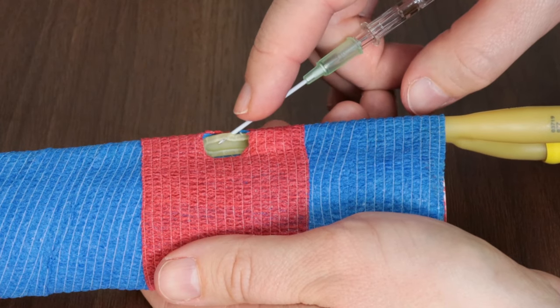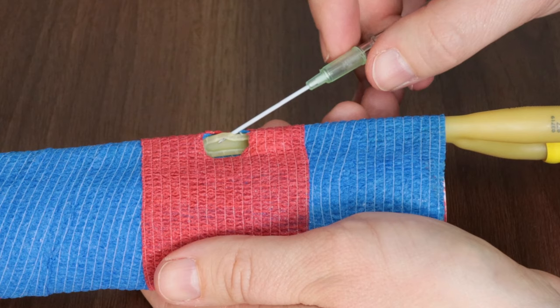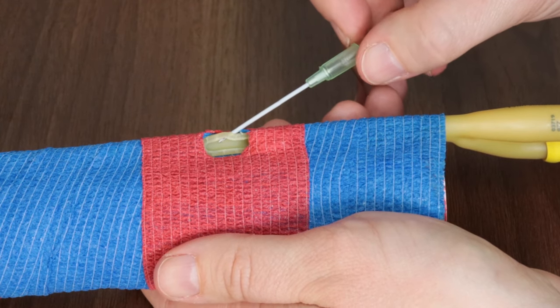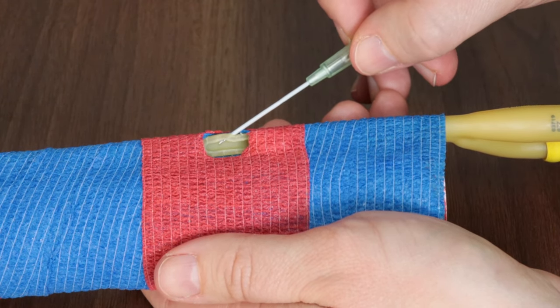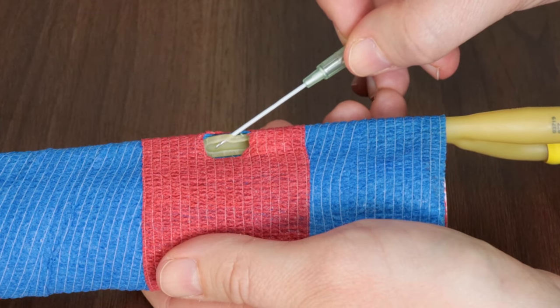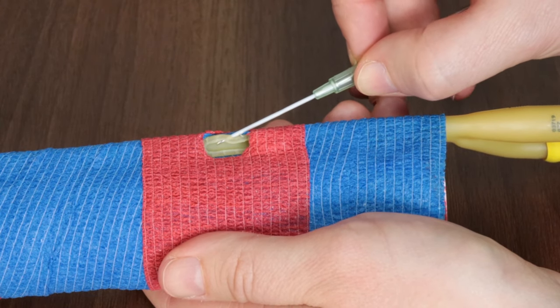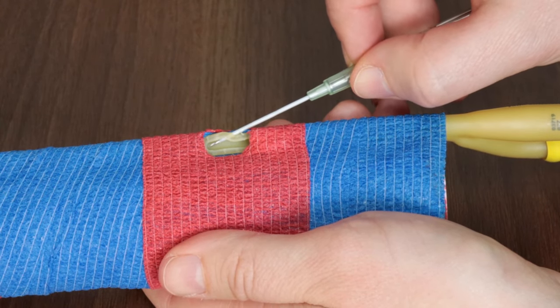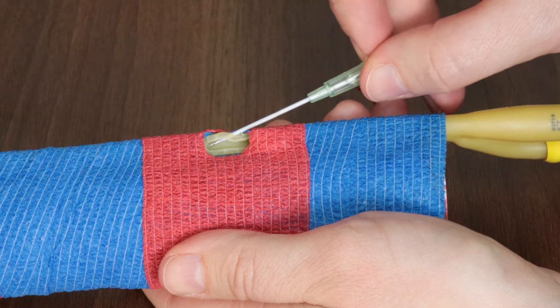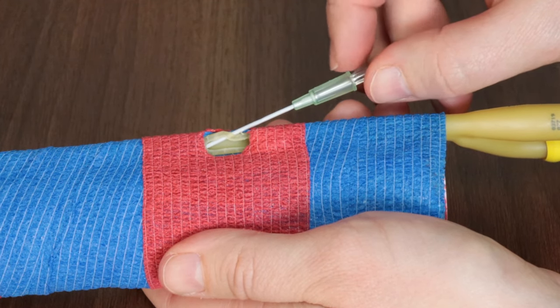But if you look closely, the actual catheter itself is still in the wall of the vein and not actually into the vein yet. If we continue at this angle, we have a chance of puncturing out the back side of the vein, then our catheter won't advance. But if we slightly decrease our angle and advance just a little bit, we're still cleanly in the vein for a nice clean advancement of our catheter.